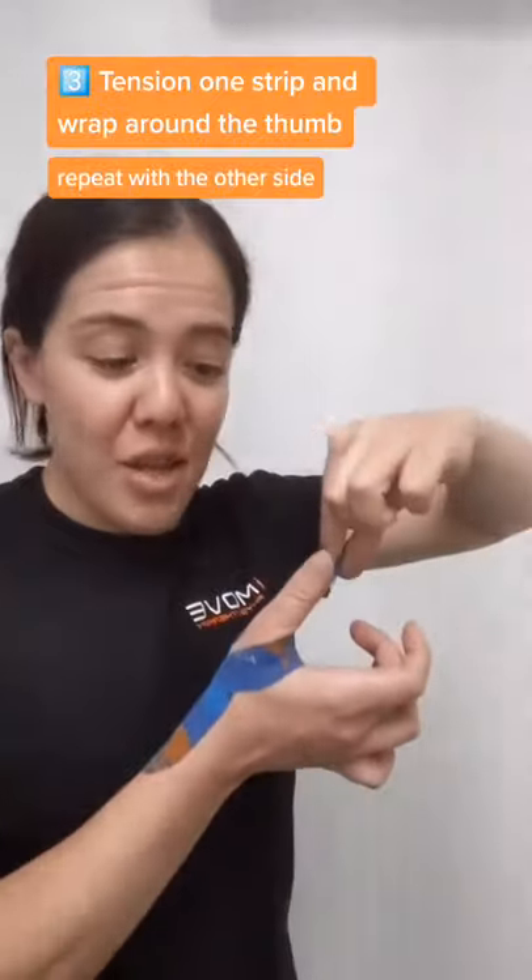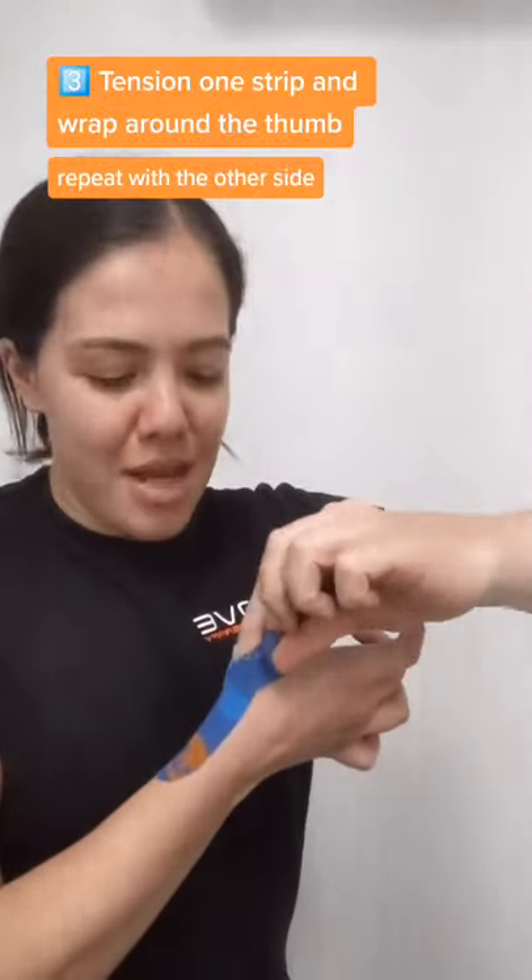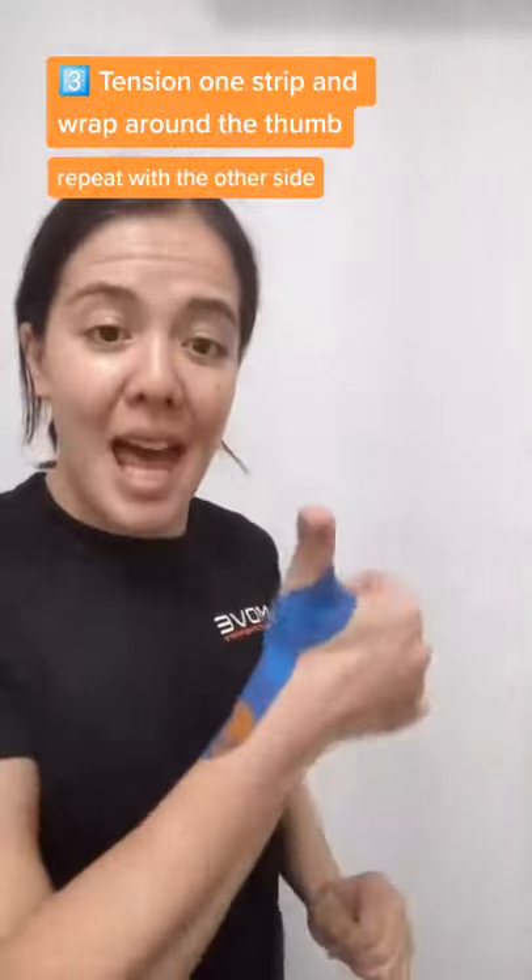You will need a little bit of tension on it, and you can do the same with the other side — increasing the tension, wrap it around the other way, secure, and voila.